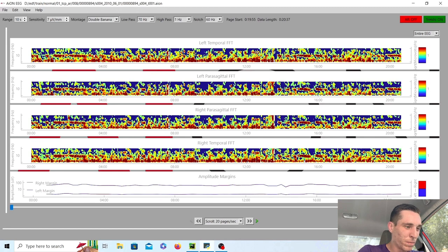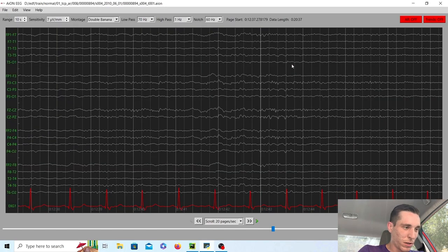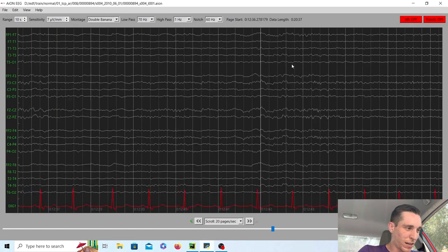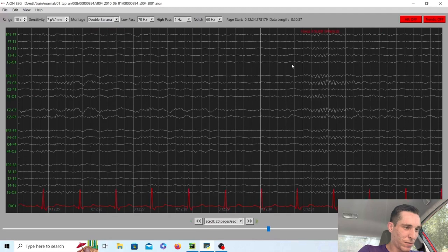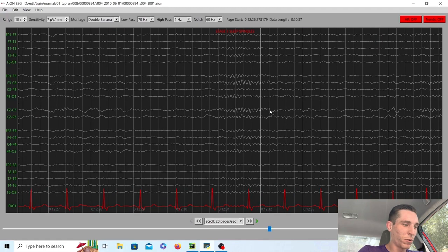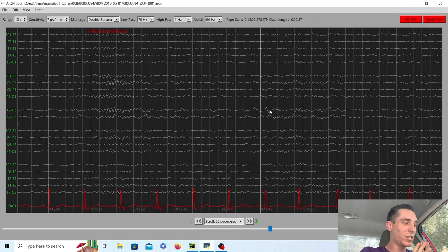So if we click here, it'll take us to sleep spindles, should be around here somewhere. Yep. Perfect. Beautiful. And that was pretty much it for this EEG.